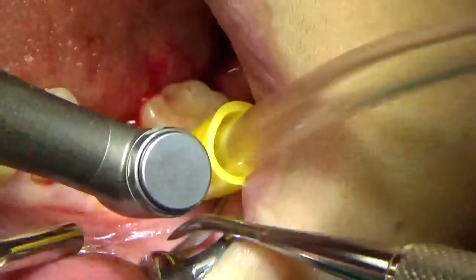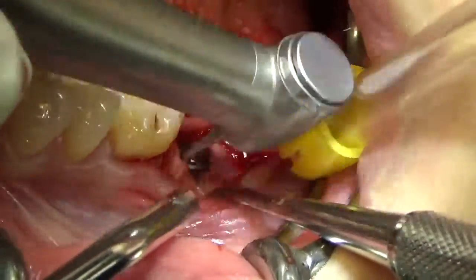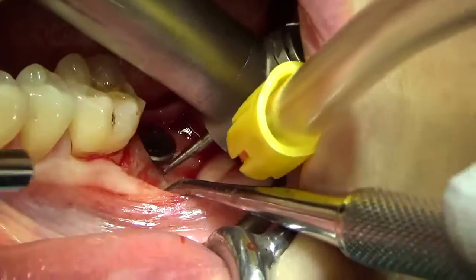So what I'm going to do is make sure that soft tissue is out of the way. I just need a couple just around. Ready?